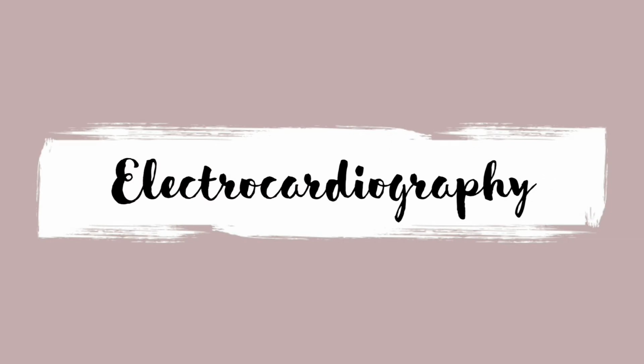Electrocardiography, also known as ECG or EKG, is the process of producing an electrocardiogram, a recording of the heart's electrical activity. An ECG is an electrogram of the heart, which is a graph of voltage versus time of the electrical activity of the heart using electrodes placed on the skin.